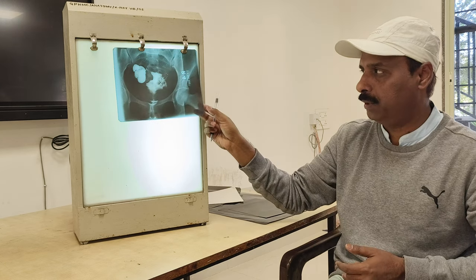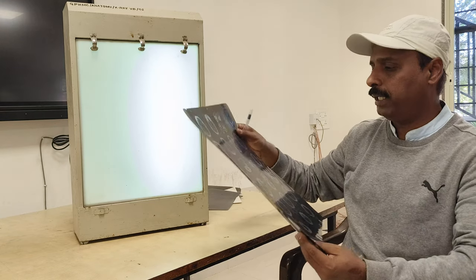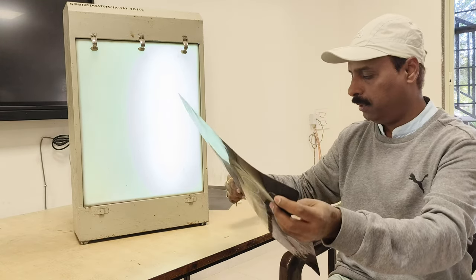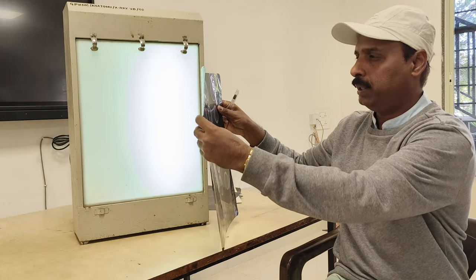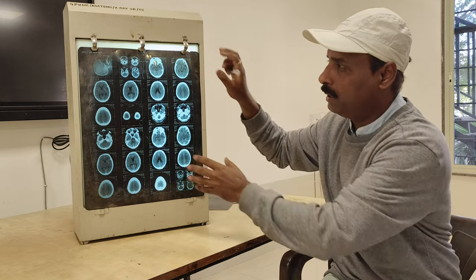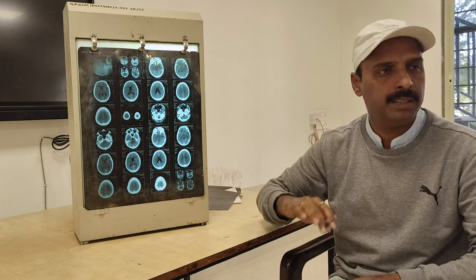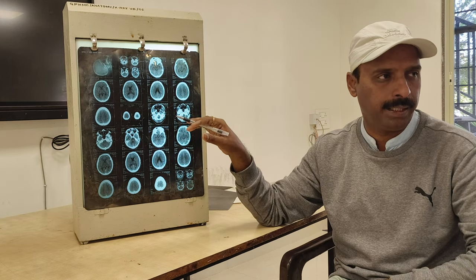Hysterosalpingography, this is one which you can remember. After this, the last one you are going to get is computerized tomography. In this, you can see all these images. You have to remember the images on the different sections of the skull or the different sections of the brain, and this is what we call a CT scan of brain.